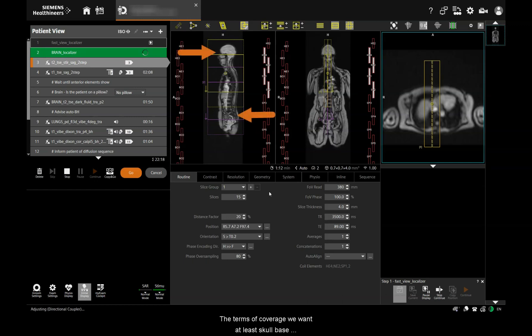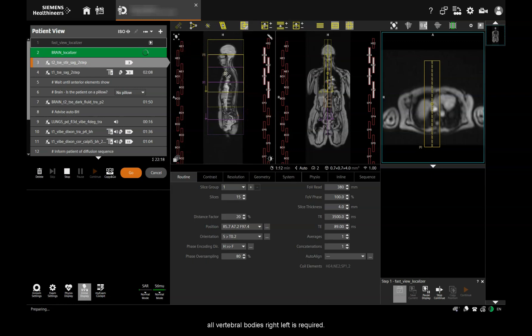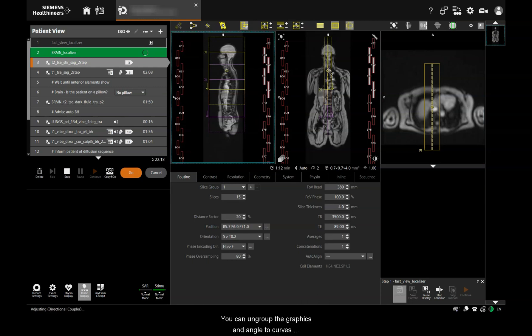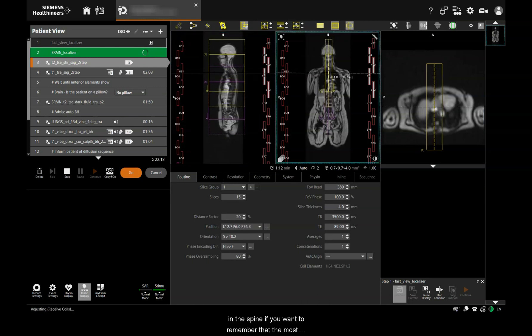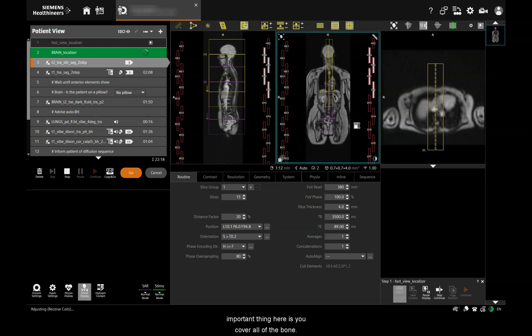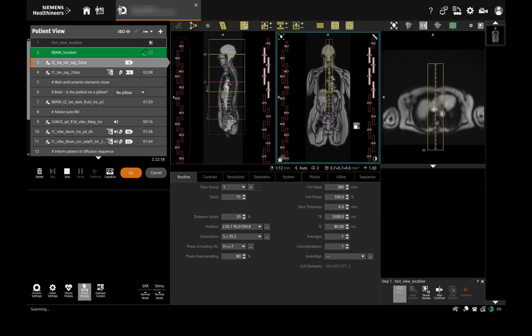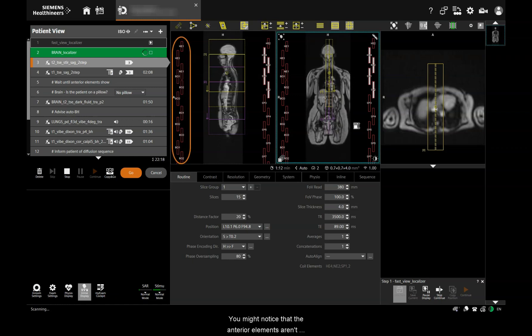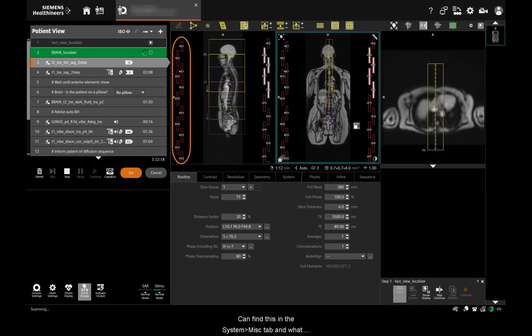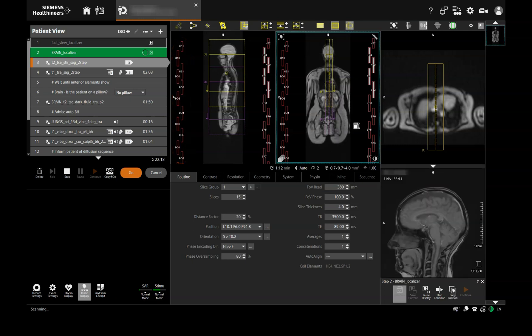In terms of coverage, we want at least skull base superiorly and the whole of S1 inferiorly, and coverage of all vertebral bodies right-left is required. You can ungroup the graphics and angle to curves in the spine if you want to, but the most important thing is that you cover all of the bone. In this case I'm just going to leave the slice group straight. You might notice that the anterior elements aren't activating while positioning this scan — that's because we're using auto coil select mode restricted, which only allows the scanner to use posterior elements. Once we're happy with our positioning, we can click go and move on.